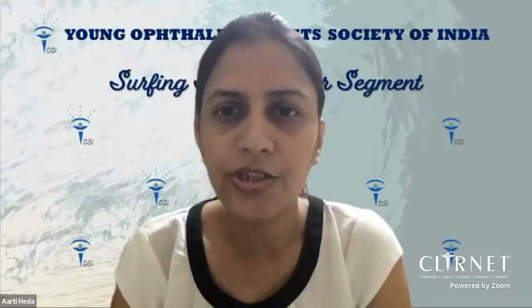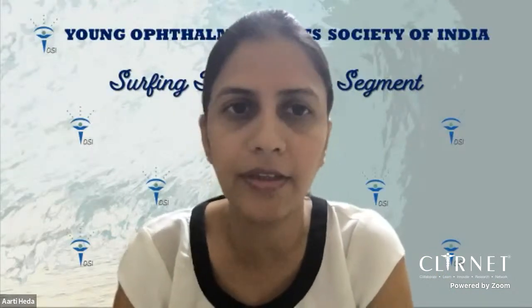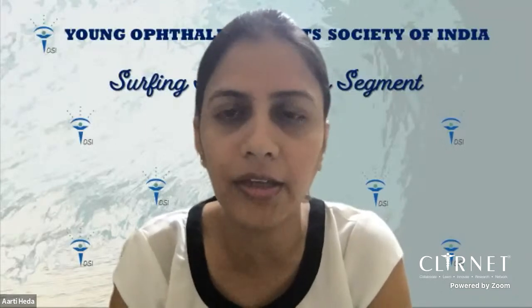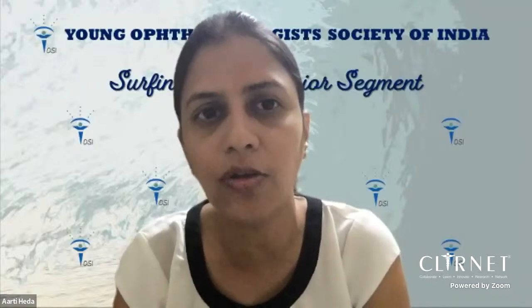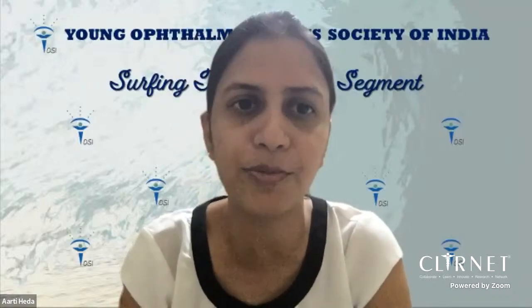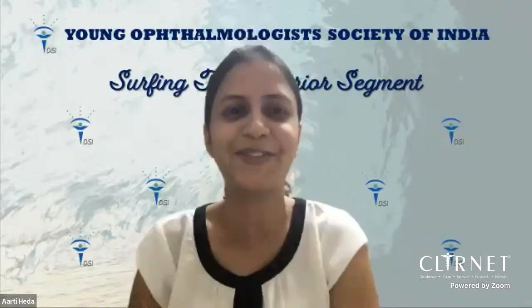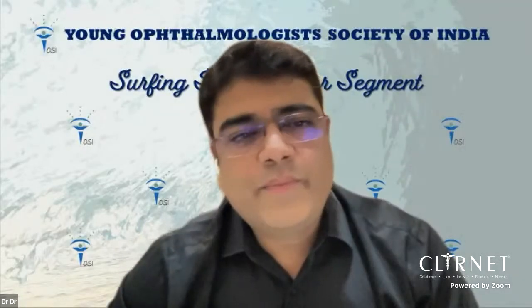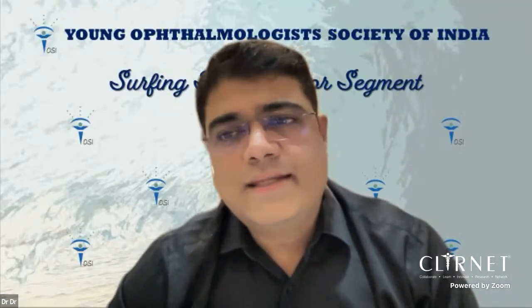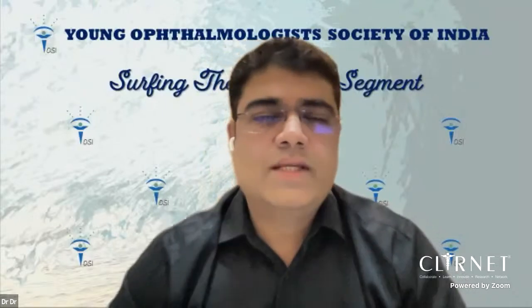So at what stage, let's say if there is already some vitreous which you can see in the pupillary area, should you clear the vitreous first and then put the triamcinolone, or as soon as you see the vitreous loss, you put the triamcinolone? My question may be very basic, but I'm an anterior segment surgeon, so I would like this to be clear. It's a very pertinent question, and I think you should put triamcinolone as soon as you notice that.